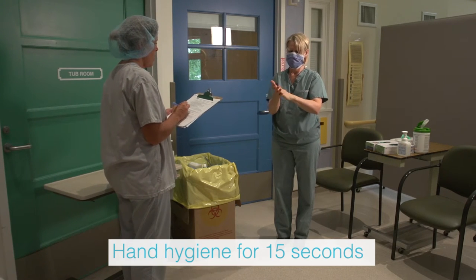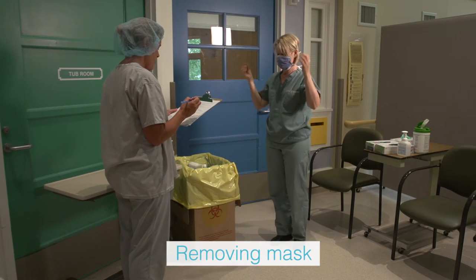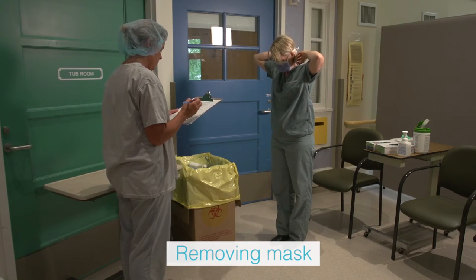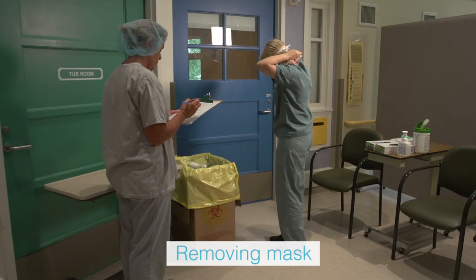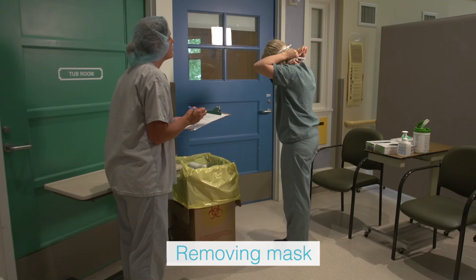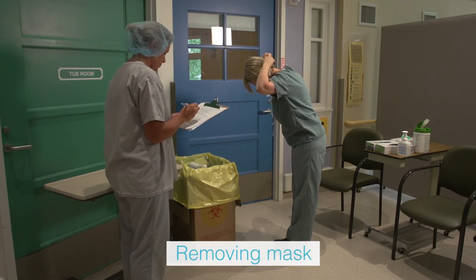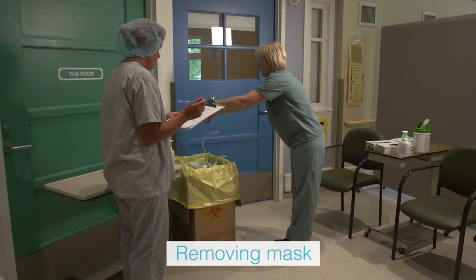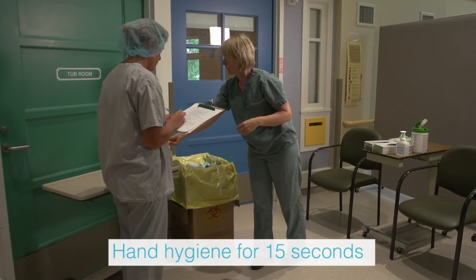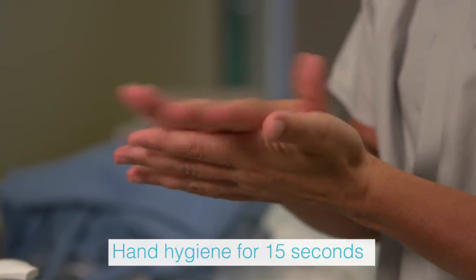The trained observer removes the mask by handling only the back straps, as the front of the mask is considered contaminated. Untie the bottom tie first followed by the top one. The mask is removed by pulling it forward off the head and bending forward, allowing it to fall away from the face. Place in the waste receptacle. Perform hand hygiene using alcohol-based hand rub and allow hands to dry completely.